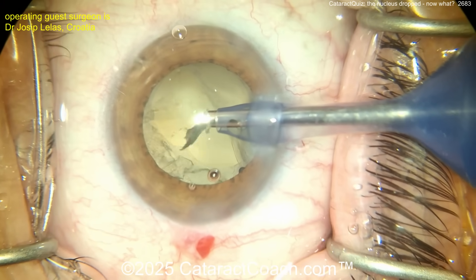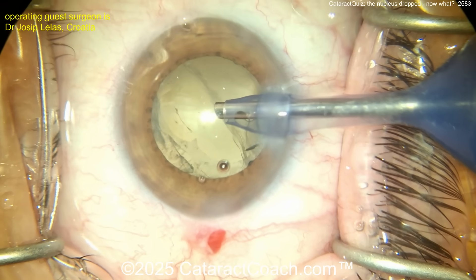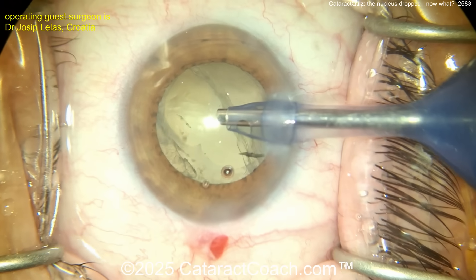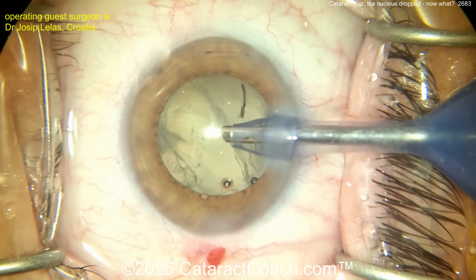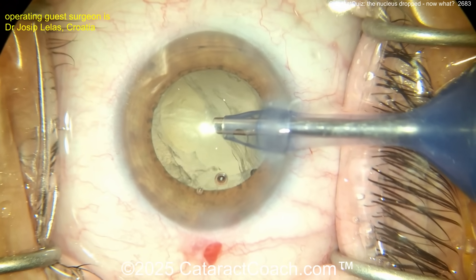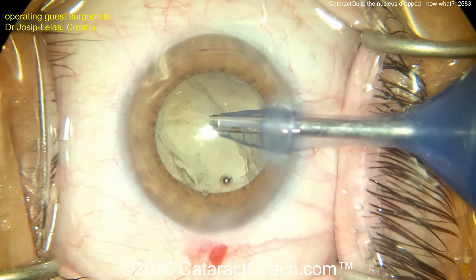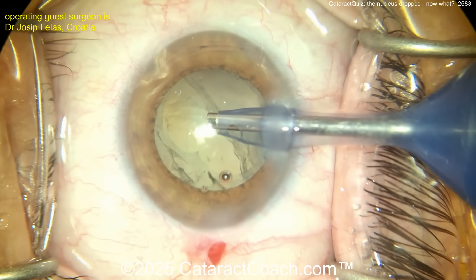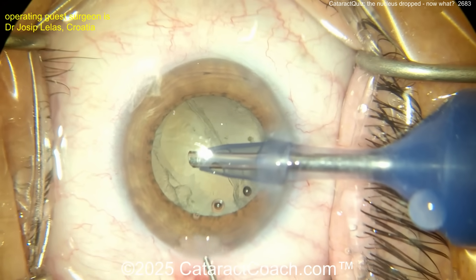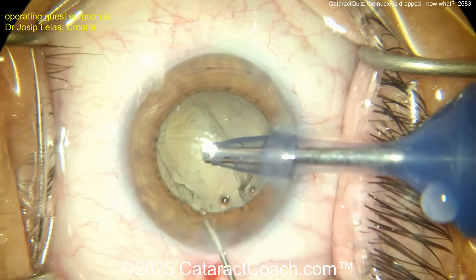You could put a little triamcinolone in right now to see if you already have any vitreous prolapse in the anterior segment. If you do, you should probably clean that up. But you can also just put the viscoelastic in, stabilize it, suture the main incision, and refer the patient to your vitreoretinal colleague. That is my advice. A hundred percent of cataract surgeons — even the best ones on the planet — have had a case where the capsule breaks and the nucleus drops into the vitreous cavity. That's okay, it's known to happen.